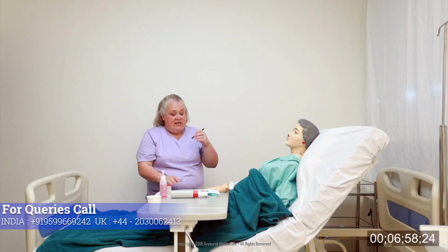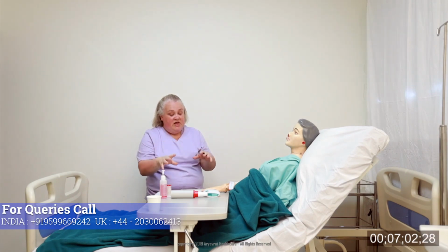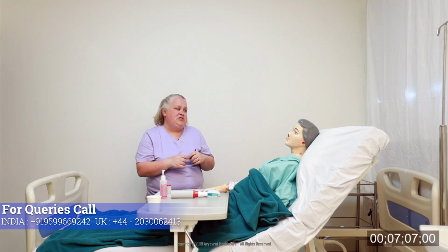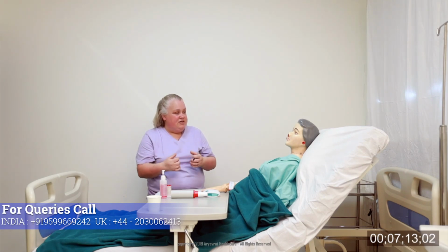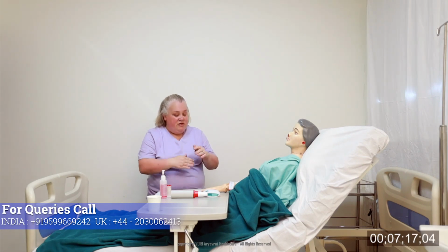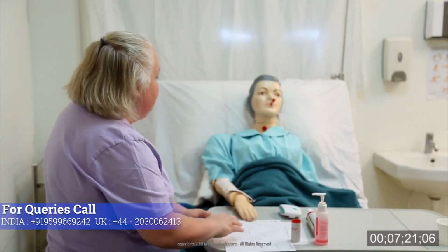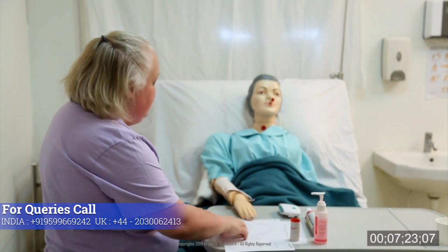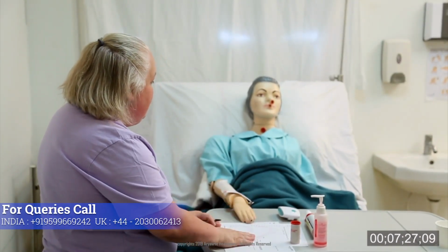Okay, so that's a little bit above what you're getting at the moment, but this is the first time you're using the technique, and you've just had your medication change. So that's the whole reason why we're doing this, to make sure your dose is sufficient. You might need to up your dose and things like that. So don't worry about the one-off readings. This is what we're aiming for. This is what someone who doesn't suffer from asthma we would expect them to get to, and things like that. So this is what we're aiming for. Don't panic. We don't have to be there yet.